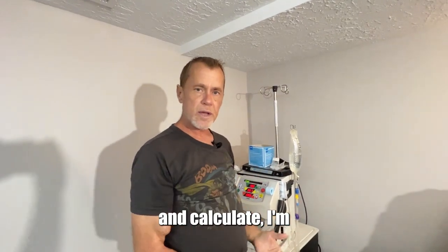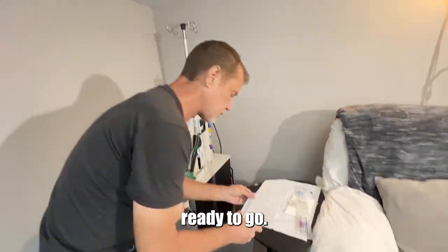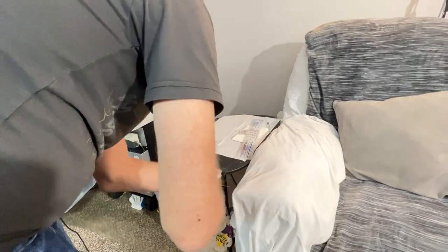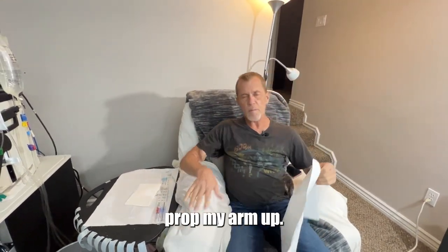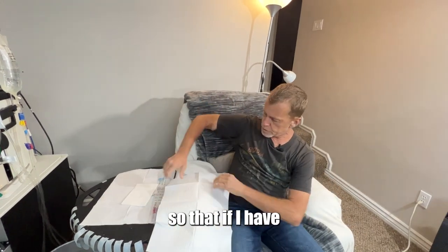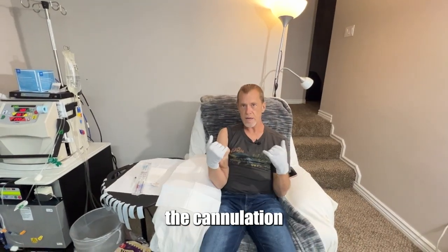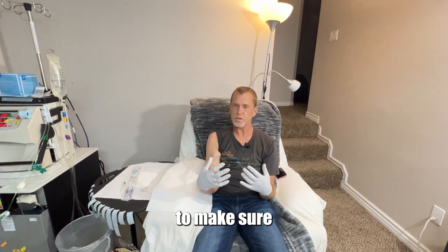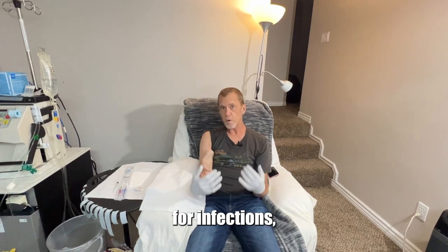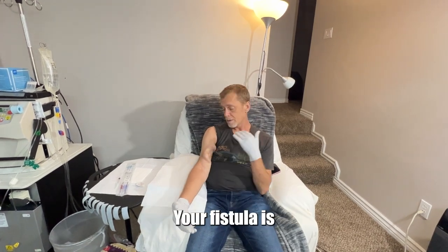Now that we are primed, snapped and tapped, and our lines are connected, it's time to actually cannulate and hook myself up. First, before I go and cannulate, I'm going to prep all my tape so all the supplies are ready to go. I keep a pillow to prop my arm up. This is a protective pad so that if I have a little blood, it doesn't leak through to the pillowcase. Put gloves on during the cannulation process — I've already washed my hands and my fistula, but we have to take extra precautions to make sure everything is sterile, watching out for infections. Taking good care of your fistula is critical — it's absolutely essential. Your fistula is your lifeline.